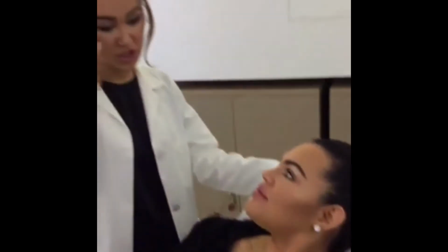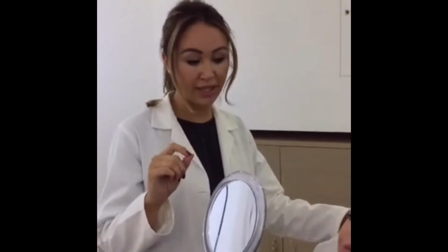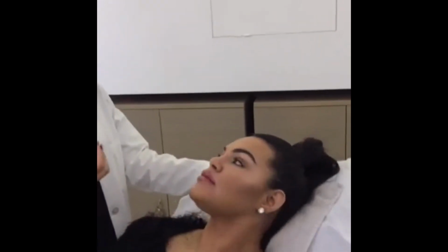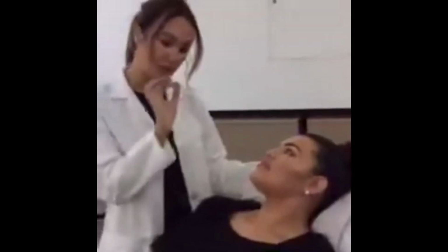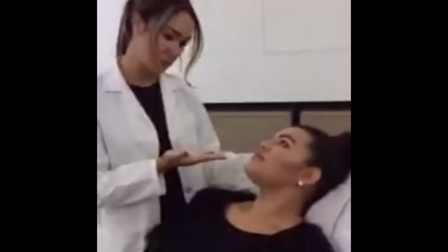The skill in your practitioner is doing micro droplets, just tiny little droplets, very gently, very slowly, not putting too much pressure on the dermal filler, and using one that's very thin and easily injectable. That stops the bruising, reduces the swelling and the pain also. We used to do dental blocks in the past, but to be honest, you don't need it. Four injections into your gum, I personally find, I've tried both, a lot more painful. It causes a lot more swelling and numbness, whereas with this technique we can be super accurate, and it feels much more comfortable than an injection in your gum.